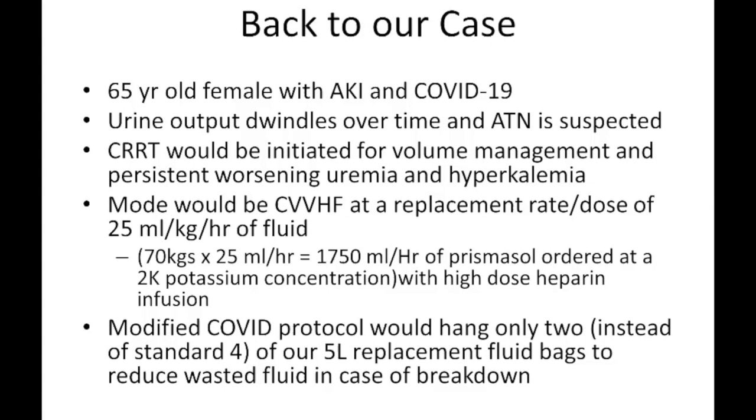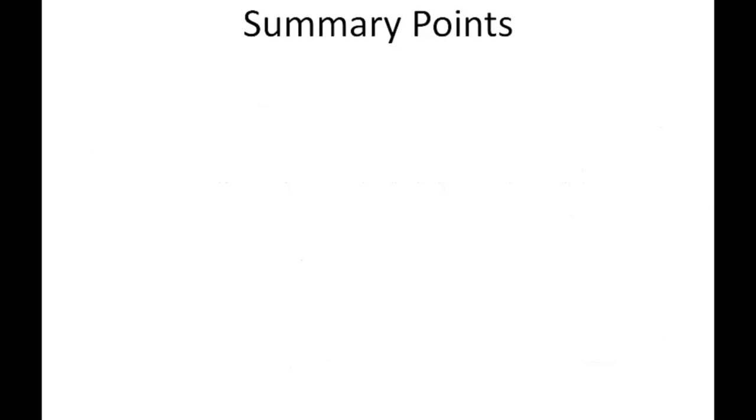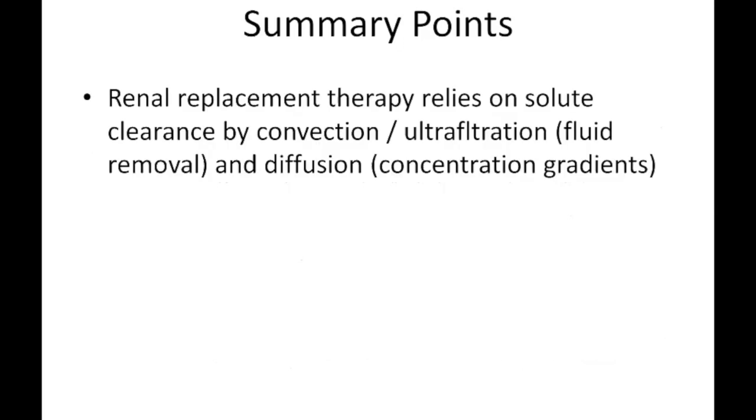In the modified COVID protocol, instead of hanging the usual 4, we would hang only 2 because if the treatment is broken down or the order is discontinued, then all the bags taken out of the pharmacy would be thrown away. So we do want to keep these dialysis fluids at a premium. So we'll hang only 2 bags on the machine in this case compared to the usual 4. So those are some of the practical points about COVID that I wanted to finish, and we'll finish up with summary points here.